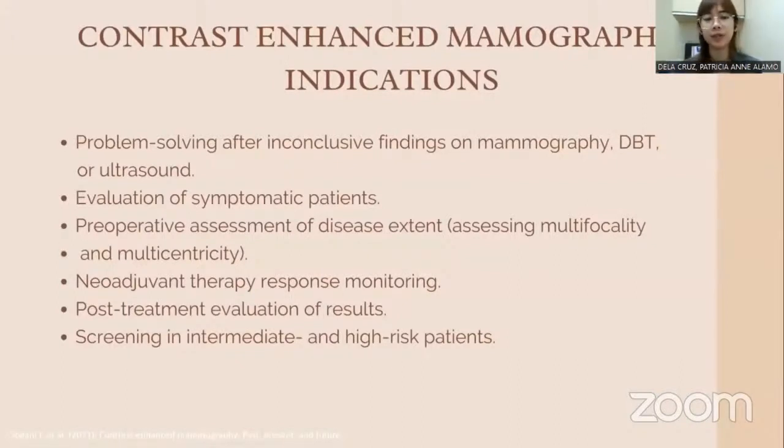It can also be used for monitoring of patients having chemotherapy or neoadjuvant therapy, then post-treatment evaluation of results, and screening in intermediate and high-risk patients. That's like what I said, patients that are having symptoms or have a family history of breast cancer.